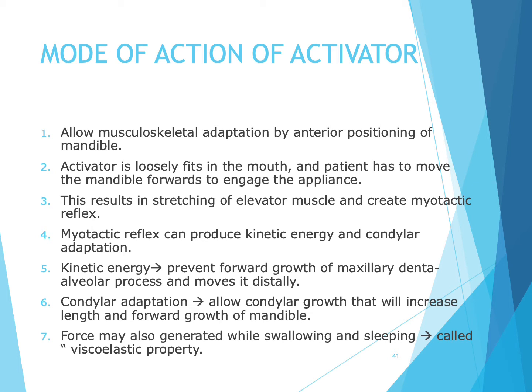Kinetic energy will prevent forward growth of the maxillary dentoalveolar process and move it distally, whereas the condylar adaptation will allow condylar growth that will increase the length and forward growth of the mandible. Force may also be generated while swallowing and sleeping, and this force is called the viscoelastic property.